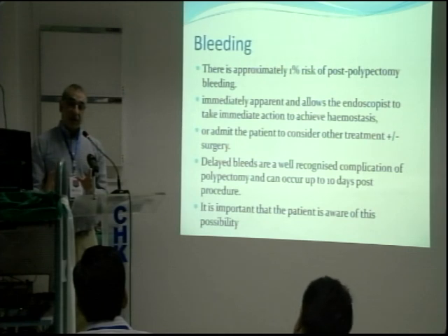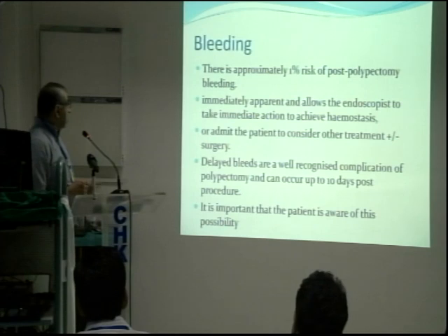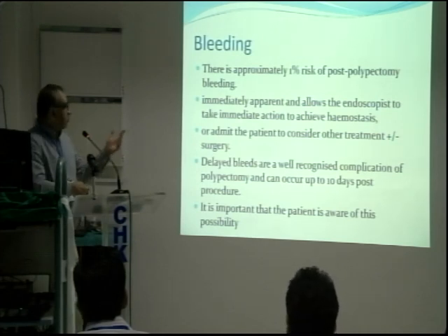So whenever I take a big polyp out, I just wait there for some time to see if any blood vessels start spurting or oozing. So always keep your polyps there. It's always useful if they bleed in front of your eyes, because almost 90+% of the time, you can treat the bleeding endoscopically.